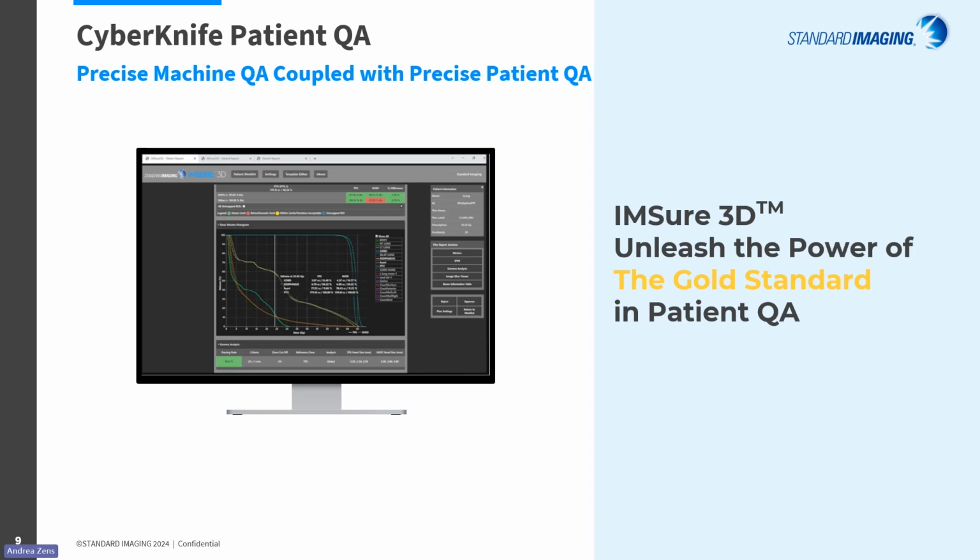So it is a question of what makes sense in terms of effective, actionable patient QA for those treated on a CyberKnife system that, again, is using fiducial skull or spine tracking to ensure accurate robot positioning. That's all about the machine delivering correctly to deliver that planned dose.